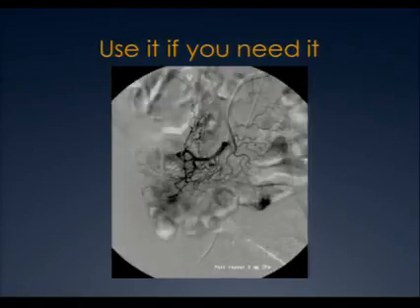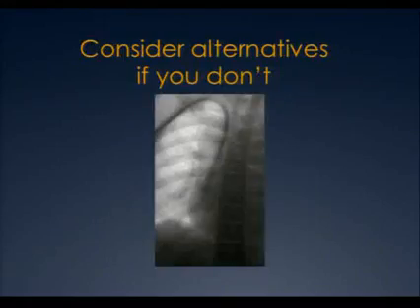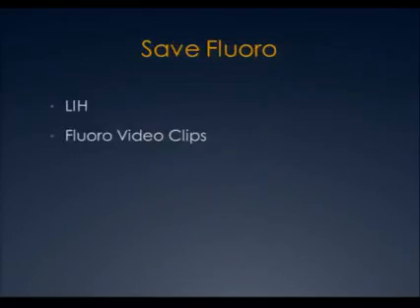I know that I can do most of this case with a low frame rate, a low DSA frame rate, and maybe even a low dose per frame until I get here where I need to see. And if it's a thin person, maybe I can leave everything low the whole time. If I'm putting a central line in, I need virtually no dose, so don't use it.